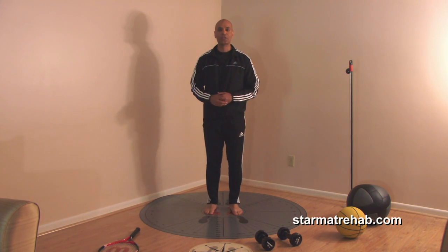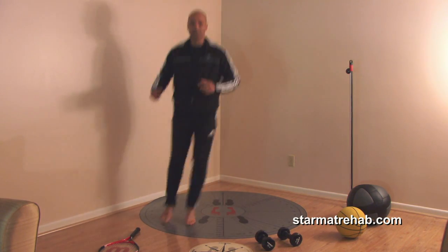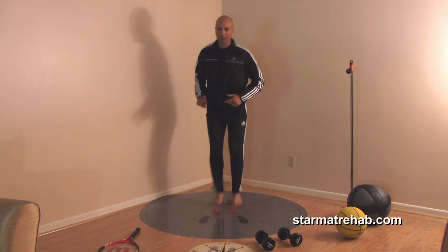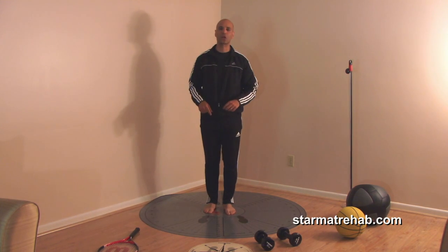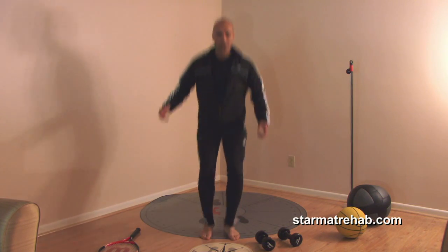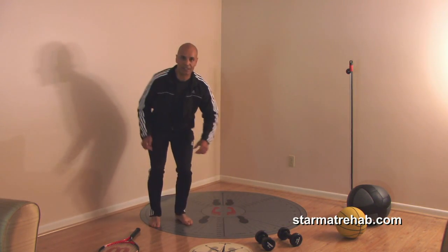The next thing you can do is jumps. Typical post-Achilles tendon rehab doesn't involve jumping, but eventually they have to start jumping. So you can do the full star — you can do it fast, clockwise or counter-clockwise.